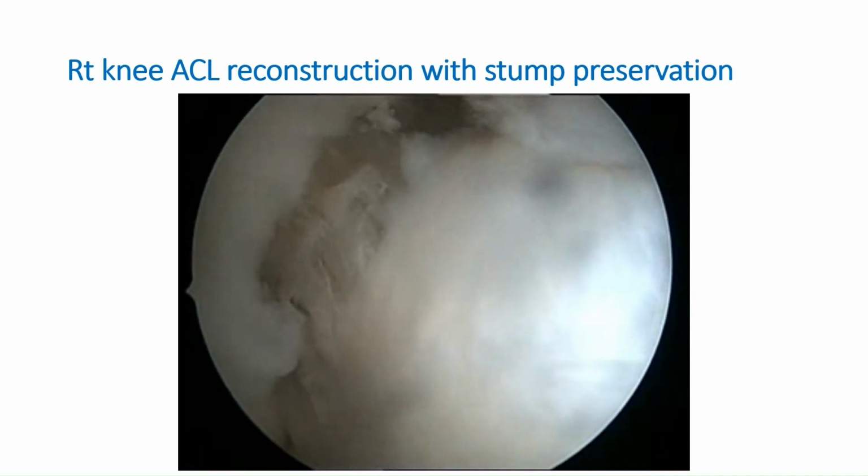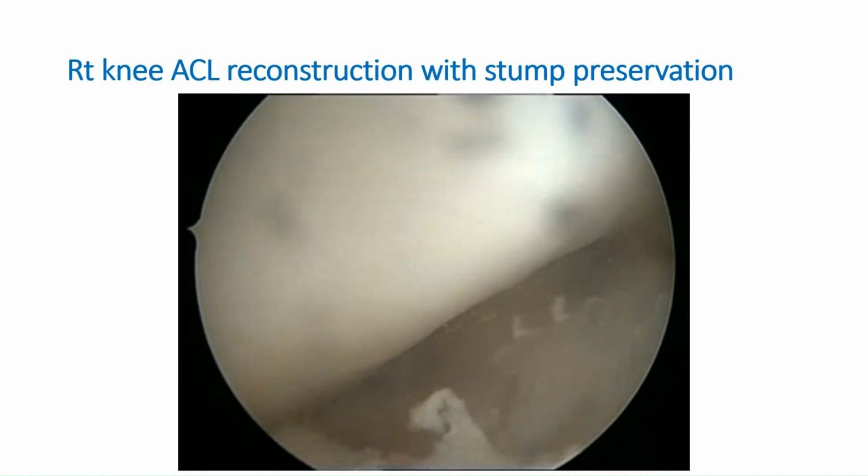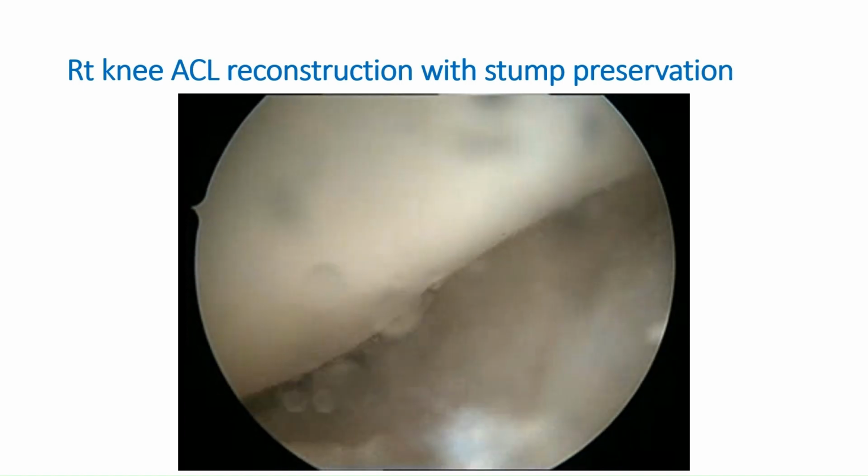Again, we're extending the knee fully to make sure that there is no impingement, and there is no impingement, as we discussed earlier.